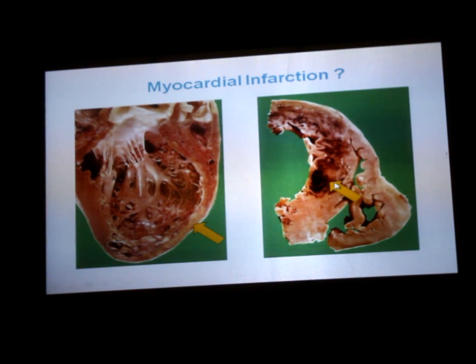This is old, this is recent. Okay, so just now there was blood supply obstruction, immediately damage to the cells, and within 24 hours changes started. So you will find a recent infarct here. Okay. This is old, this is recent.